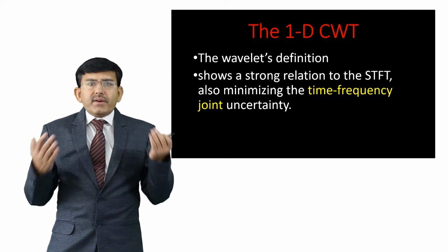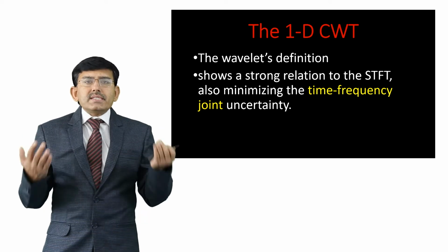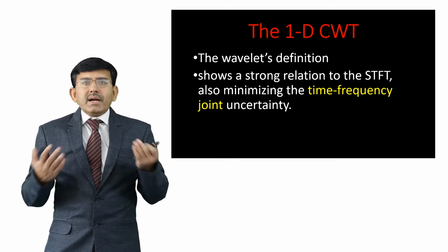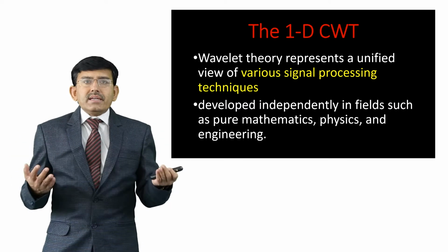The wavelet definition shows a strong relation to the STFT, also minimizing the time frequency joint uncertainty.